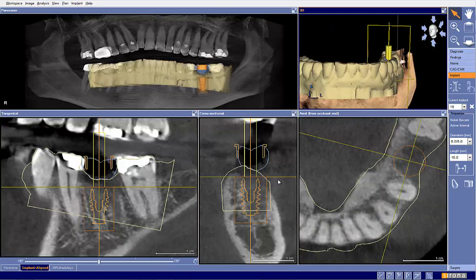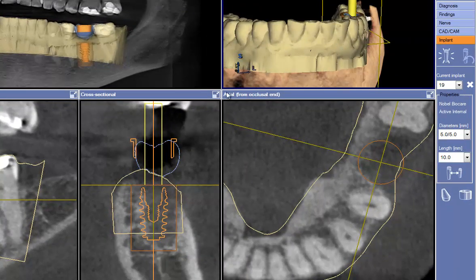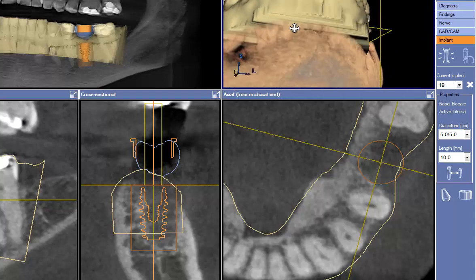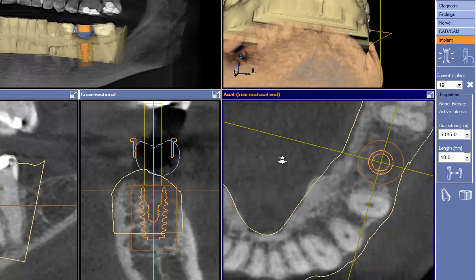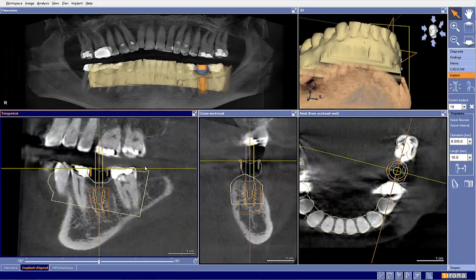Now again, that's assuming that this can all be done, and based on what I'm seeing here, that does seem plausible. While I'm on that discussion, this is a case where I would do a crestal incision and move the tissue out, not necessarily a tissue punch. I do have questions in terms of how much keratinized tissue we'll have based on this implant position as we have it here.